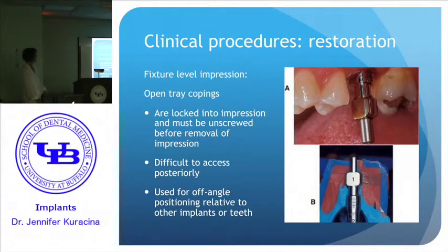Again, this is from one of their lectures explaining what an open tray impression is, and again, we're not doing these downstairs all that often.